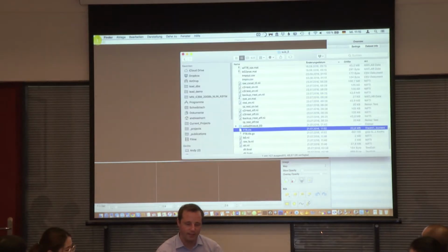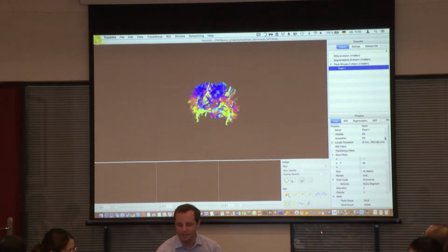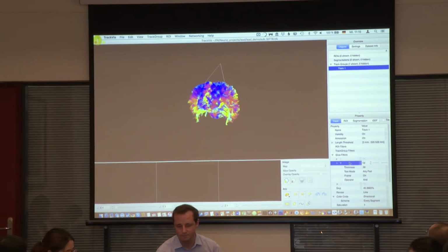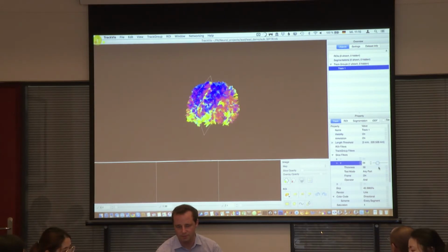TrackVis is again this software from Boston, from the Martinos Center.